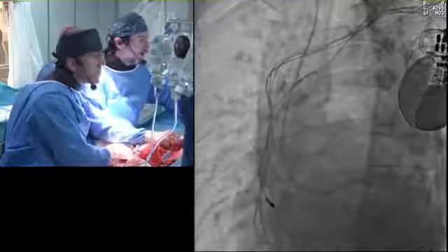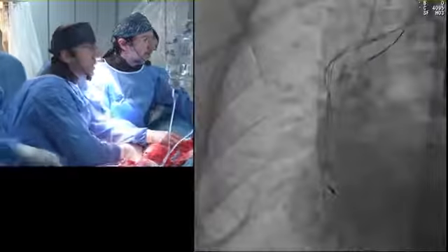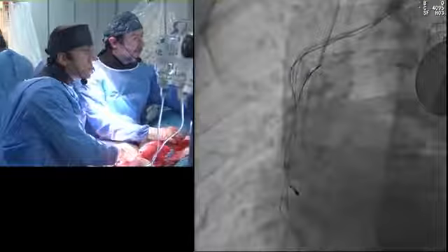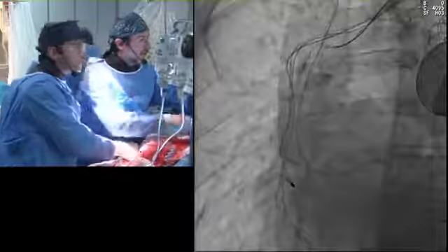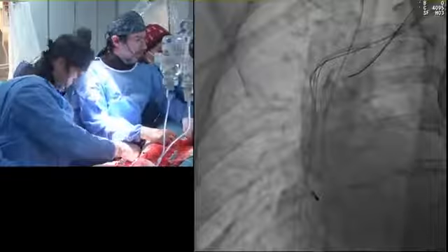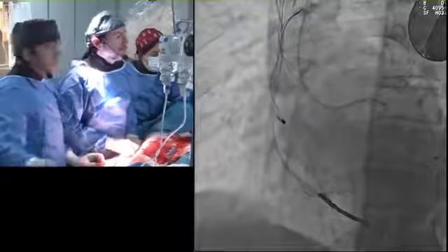The only hope, I think, is that the wire will go into my loop and then I will catch it. You can go a little bit back. Geri gel istersen. So yeah, this is not going to help me. Maybe I can push this. Wire is up. Okay. Aşağı çek. Gösterir misiniz bana? You have to pull the wire back into the catheter and push it again. Yep. You think so? Yeah.